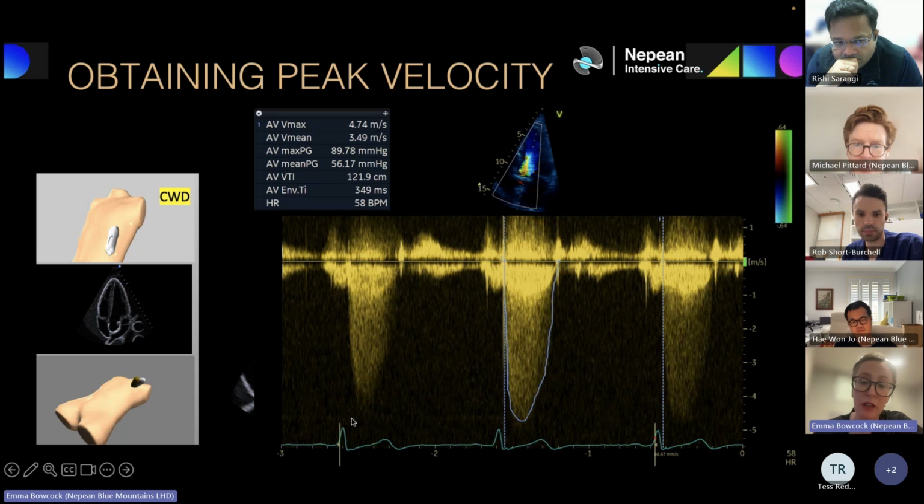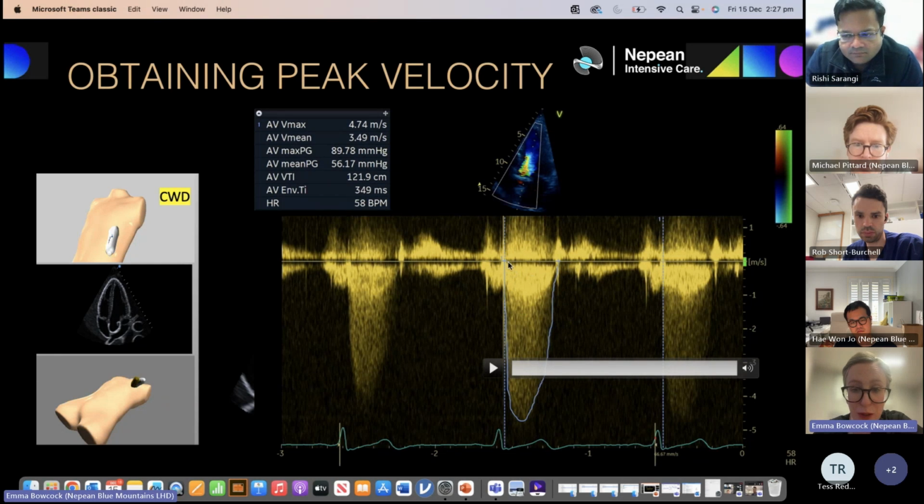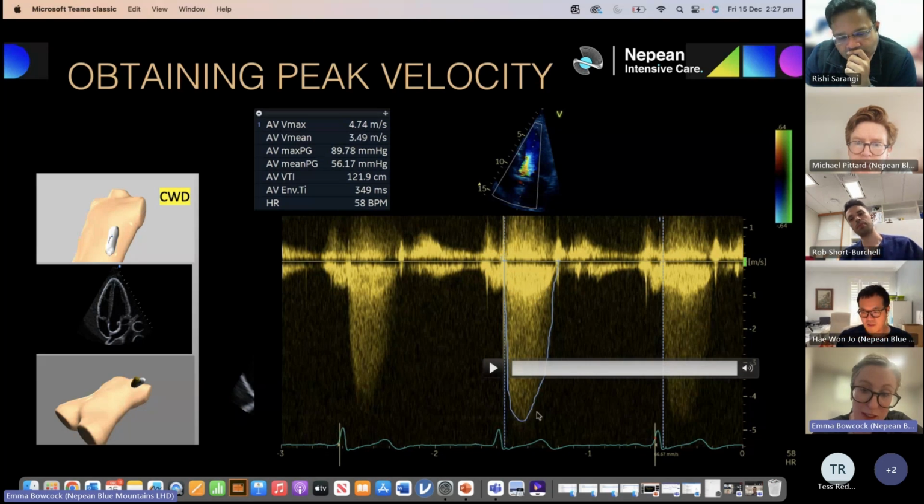So in aortic stenosis, you'll often see this sort of spectral Doppler profile, where it can often be brighter initially up here, and this is actually your V1, like your LVOT flow, which is the predominant red cells coming through at this sort of velocity prior, and then the rest of your red blood cells are coming here, and the peak velocity is the one that you are interested in. So obviously not having it overgained, ignoring the fuzz and all of that is important. We'll talk through some of that.